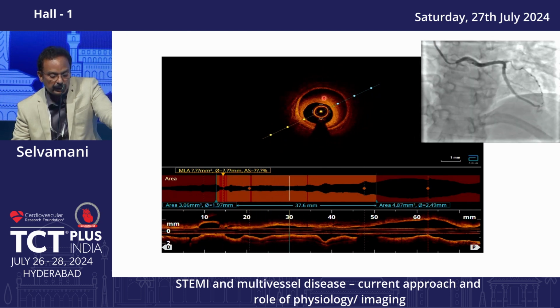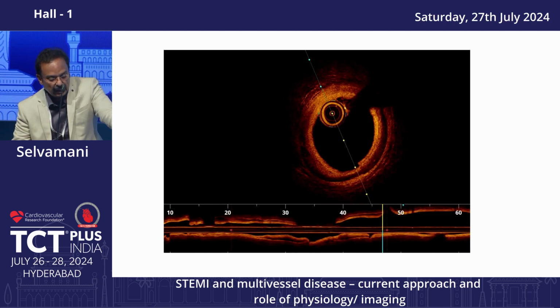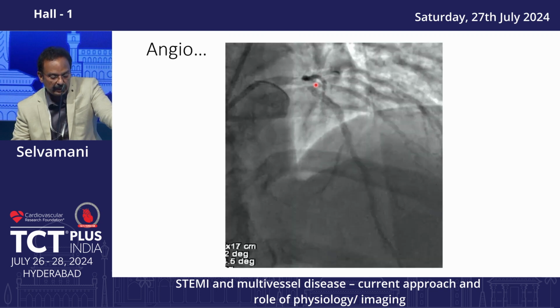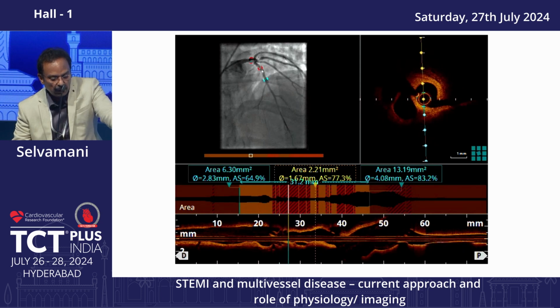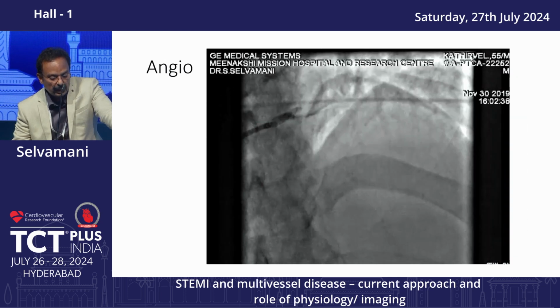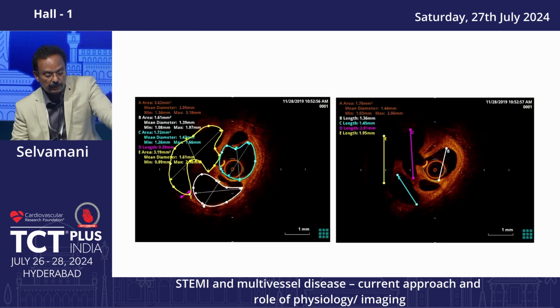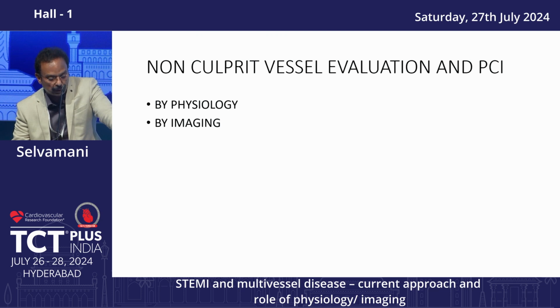It is a spontaneous coronary artery dissection which has occurred, and that is why this patient had these changes. Look at the longitudinal lumen, it clearly gives that idea. A lesion like this is not just an ACS, but probably a recanalized thrombus. All these things you cannot make out on an angiogram, and OCT definitely gives a very good idea, and IVUS helps you a lot in treating patients with STEMI. So imaging plays an extremely important role in STEMI today, and you can decide the treatment, whether to defer it or stent it, and of course during the procedure to produce an excellent outcome.